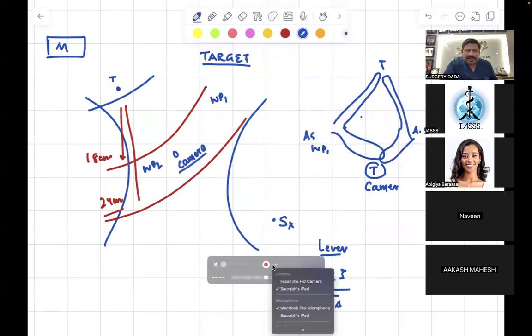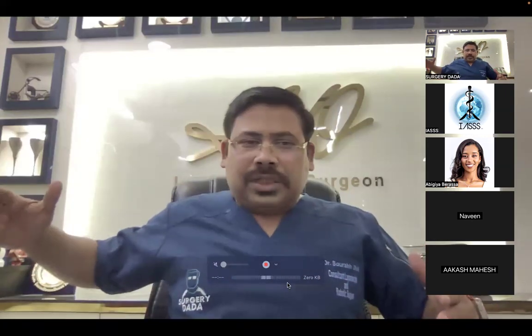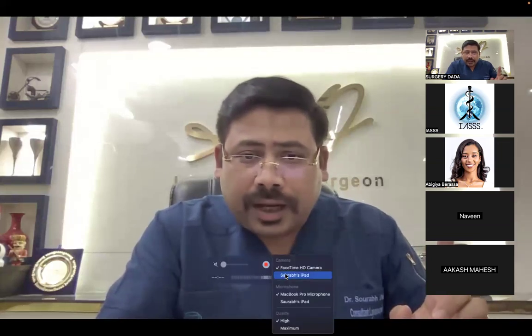Now, one student can say, sir, I can place my working ports like one port is this far away, one port is this far away. Now, try to understand. The ports are too far. When the ports are too far, one hand is coming like this, the other hand is coming like this. Can you imagine the angle and the strain you are having at your shoulders? So, the angle between the two working ports is what is known as the manipulation angle. So, the next thing that we have to understand is the concept of manipulation angle.